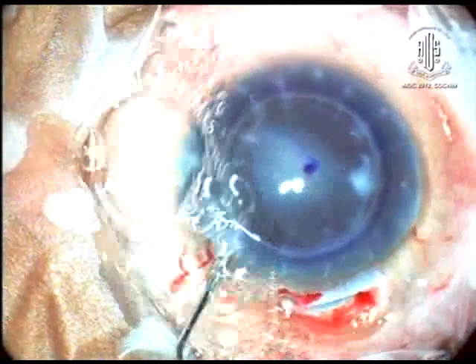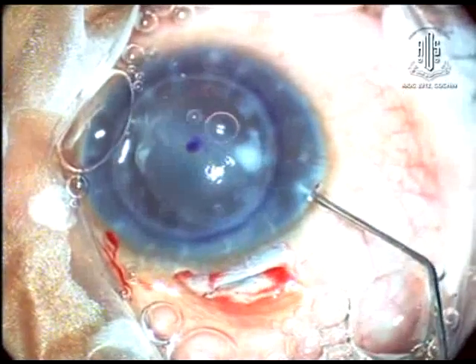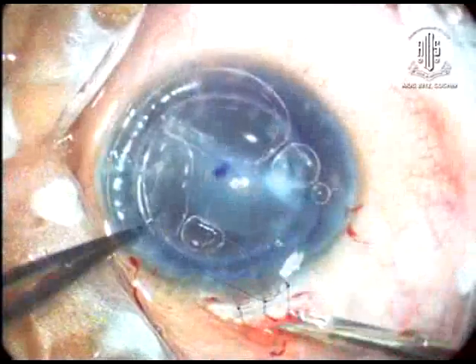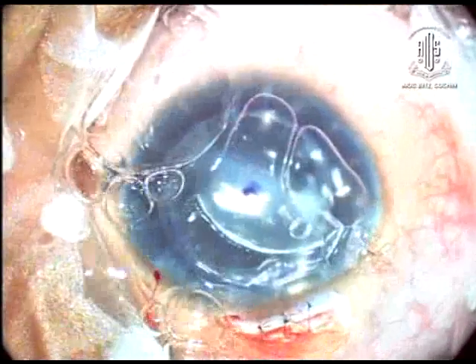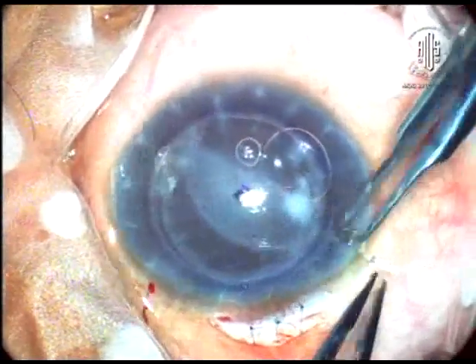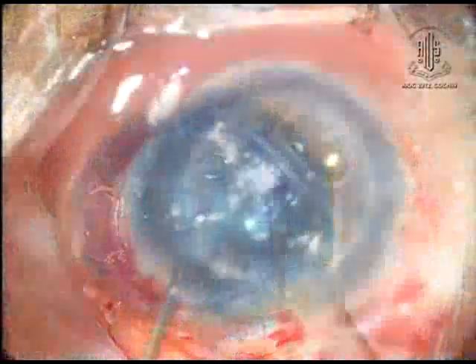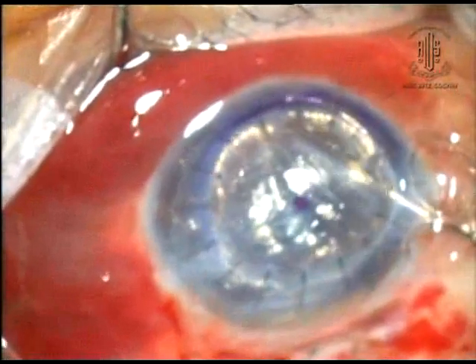Furthermore, injected air tends to escape through the main and side ports because of low scleral rigidity. Suturing the main incision is very helpful, but it may not be sufficient at times. Still, the air tends to come out. Suturing the side port and a jet of BSS is then required to unfold the tissue. Sometimes a little manipulation from the side port is all that is required.